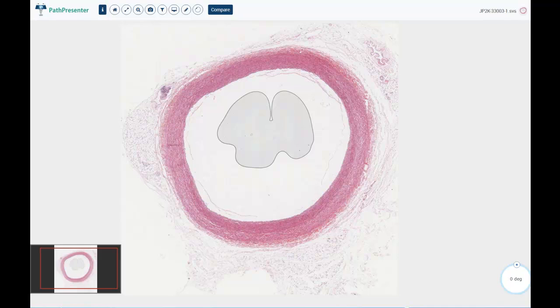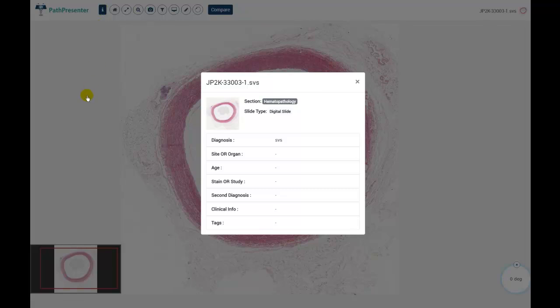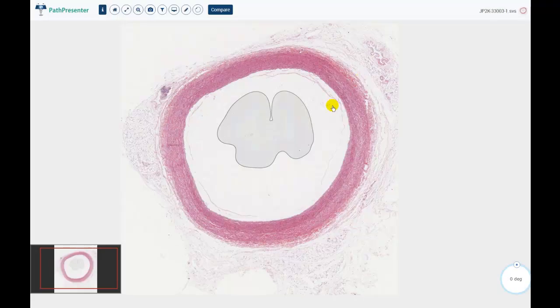This is a specimen that I found on Path Presenter. It is a large artery, and it's obviously stained with hematoxylin eosin. However, on this website that has a lot of path slides, it's under the section of hemopathology. It's a digital slide. Its format is an SVS slide, but there's no more information there. But I thought it was interesting.